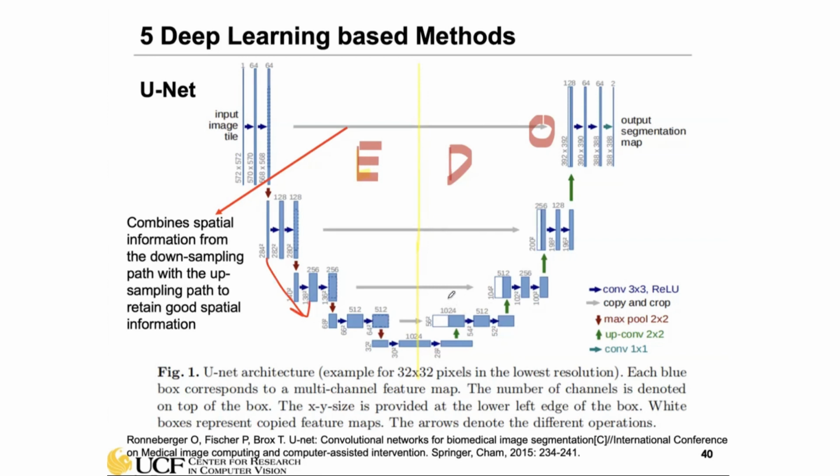If you think about it, at the initial decoder stage the spatial resolution can be very small because of the gradual pooling, and we have lost a lot of spatial information. We are just doing some simple upsampling, using bilinear or bicubic interpolation, but that information is very coarse. Based on the limited spatial information, doing simple interpolation doesn't give you much additional information.